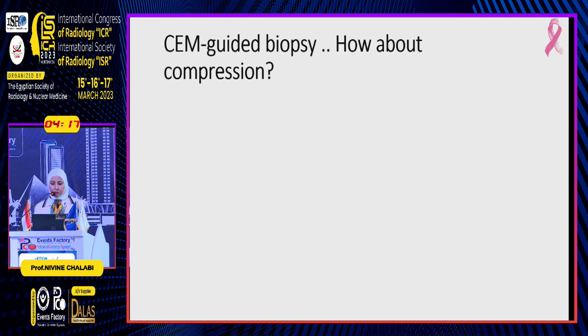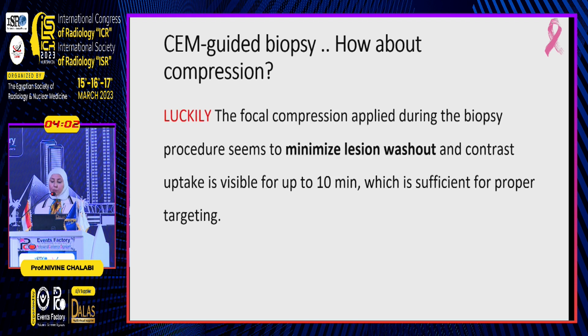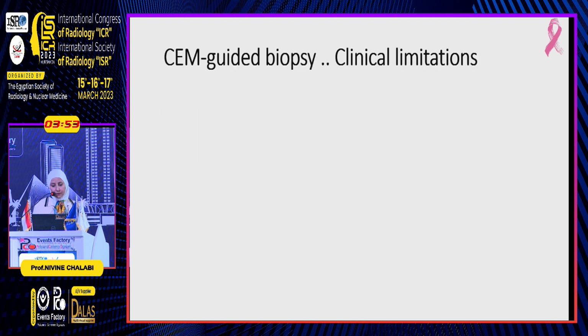How about compression? In the regular contrast-enhanced mammography procedure, we wait 2 minutes until the contrast has reached the lesion before we start the compression, so as not to interfere with the blood flow in the breast. However, luckily, in the biopsy setting, the compression that we do minimizes the lesion washout, giving us a window of time which is sufficient for proper targeting.